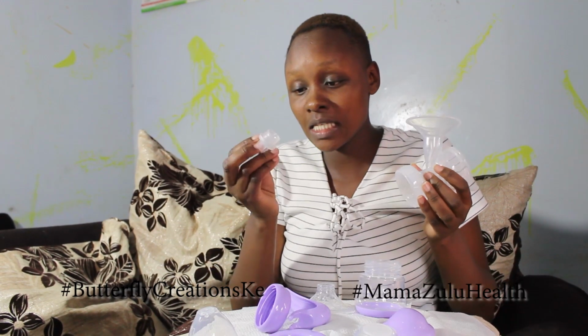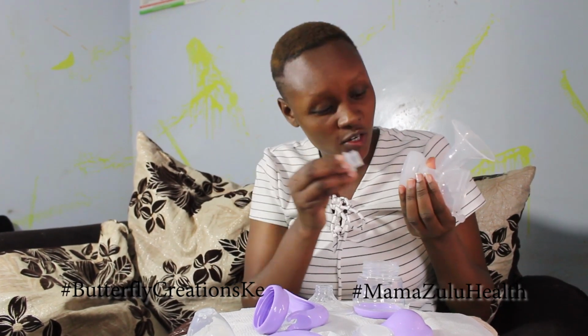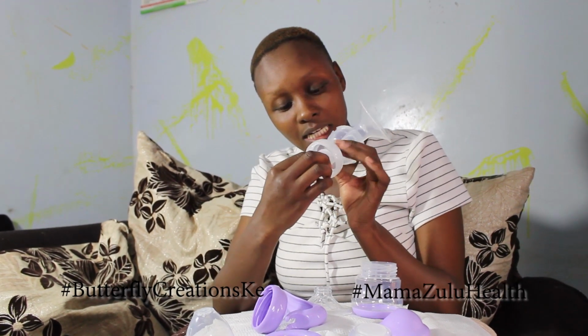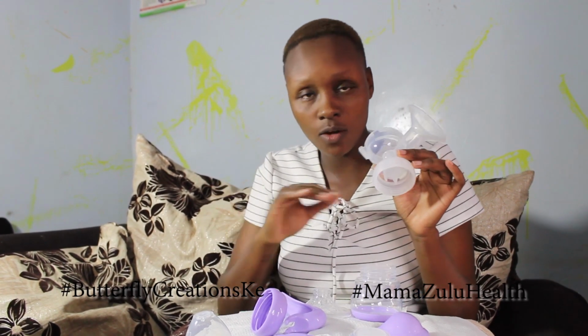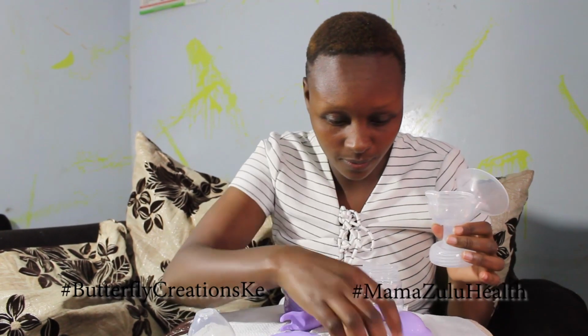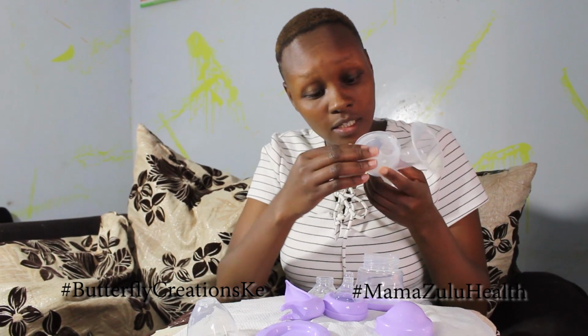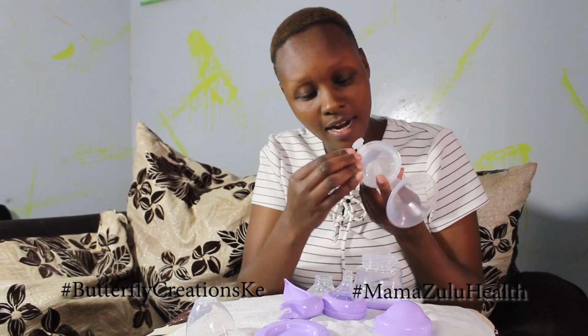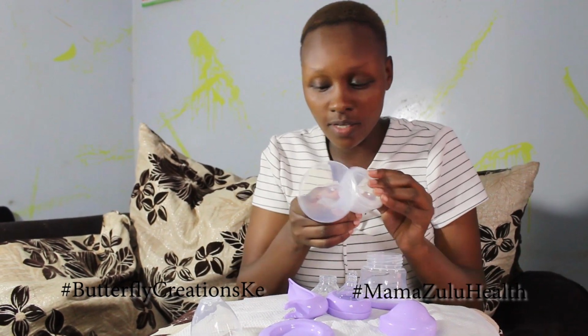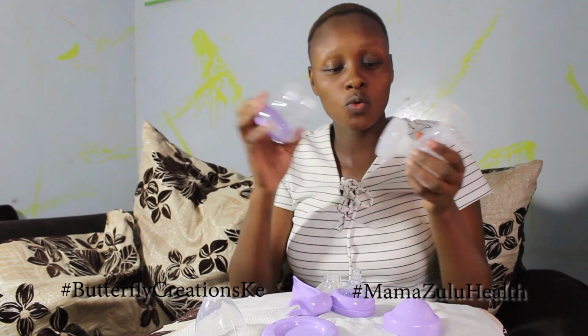So you start with this. This one is used to apply pressure. So you do this down here. I hope you can see this clearly. So make sure it settles there. It fits completely without coming out. You can see that. And then up here, there is this thing. So you press it until it fits completely. Like this. And then when it fits, you go to the next step where this is where you get your milk.